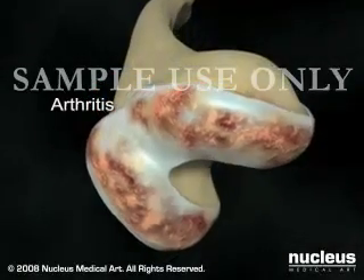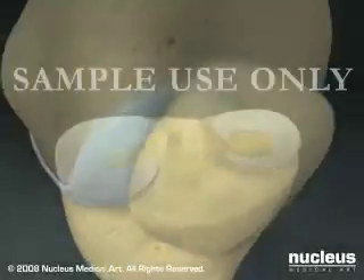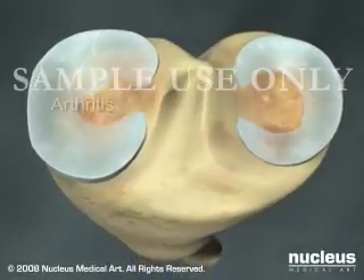If your physician has recommended a total knee replacement, it is probably because your knee is severely damaged by arthritis or injury.